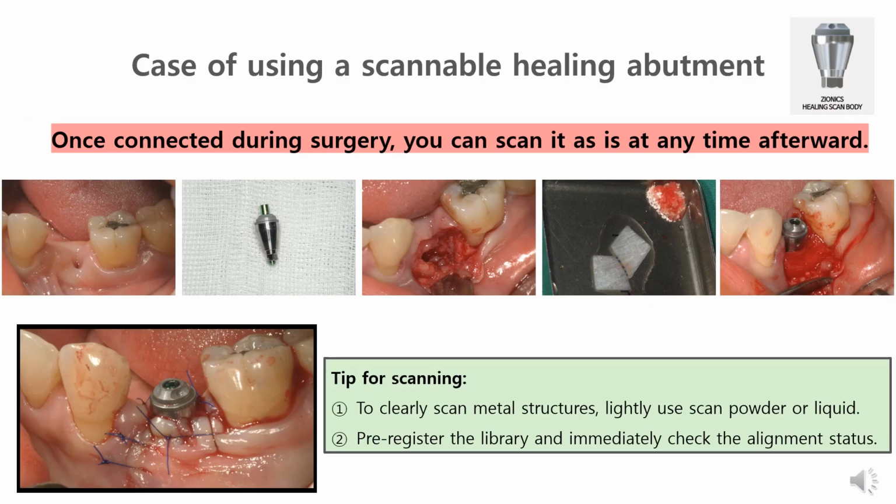Then let's look at an actual patient case using the simultaneous scan workflow. Dr. Zhang personally prefers to simplify the workflow and maximize patient comfort by connecting a metal scan body in the form of a healing abutment during surgery.